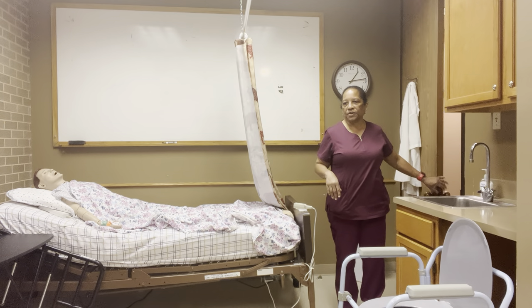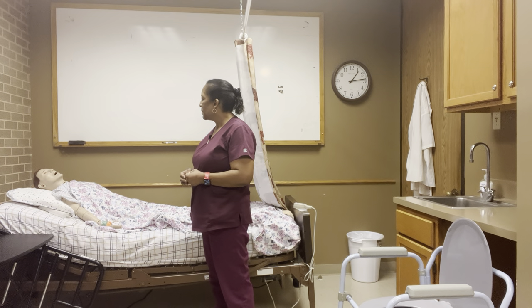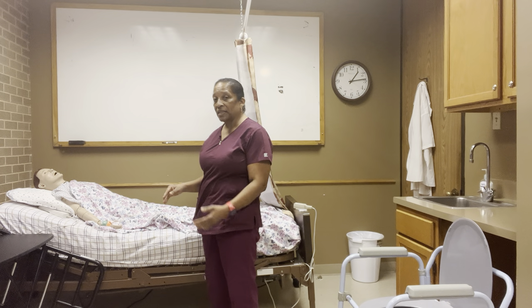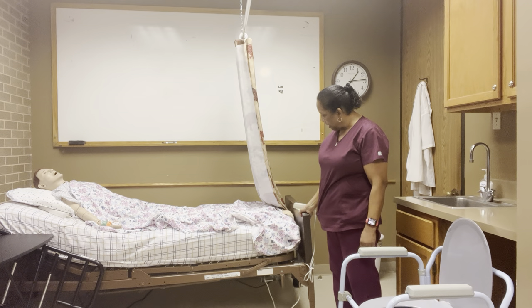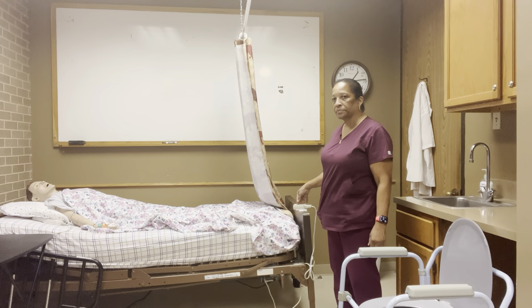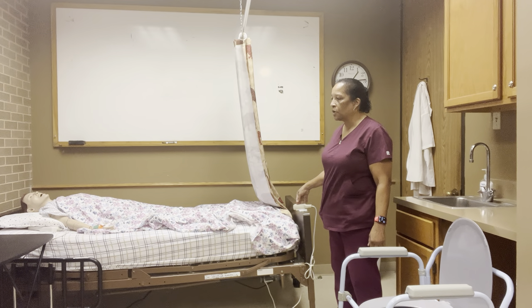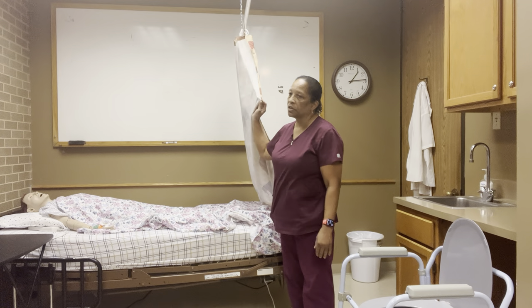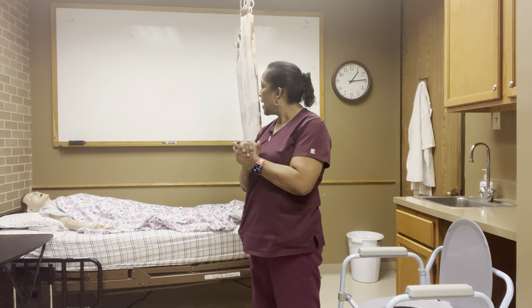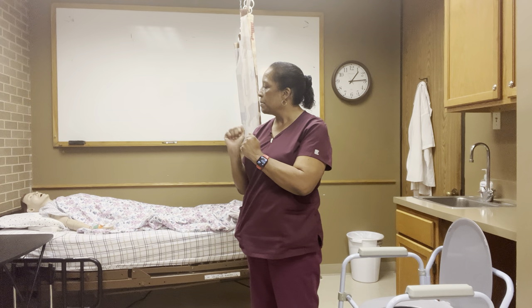Good morning, Miss Mary. How are you doing? My name is Dr. Lee and I'm here to put you on the bedpan. Is that okay with you? Super. First of all, I see that you are not supine, meaning that you're not flat in bed. So I'm going to go ahead — I see that the bed is low and my wheels are locked. I'm going to go ahead and put your head down so that you're flat in bed, all the way flat supine. I'm going to pull the curtain to provide for privacy, and then I'm going to go ahead and wash my hands and get my supplies and I'll be back. My hands are already clean because I'm washing them, and I'll be back to get you on the bedpan.